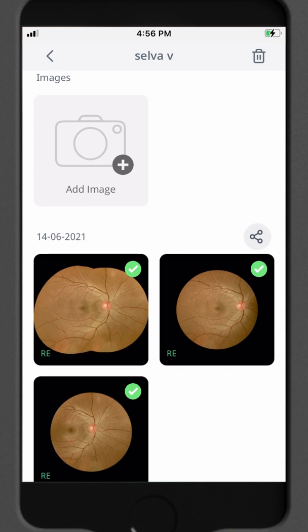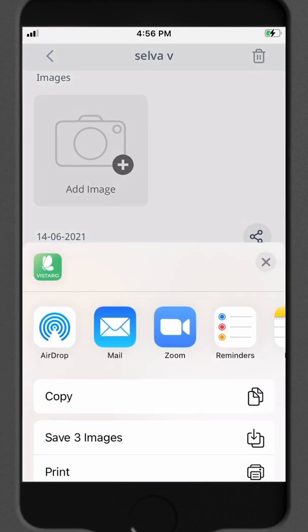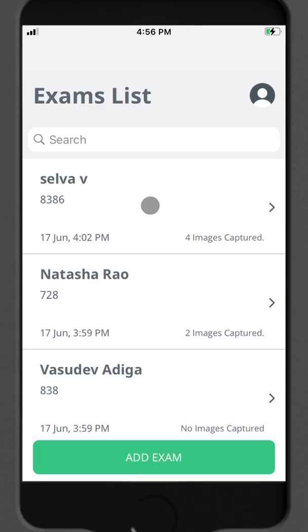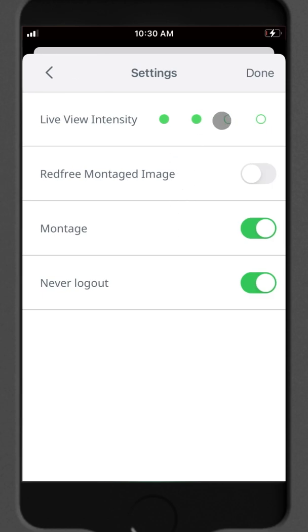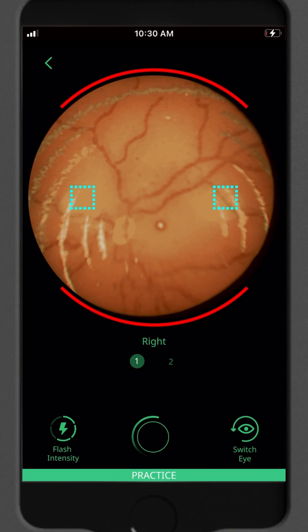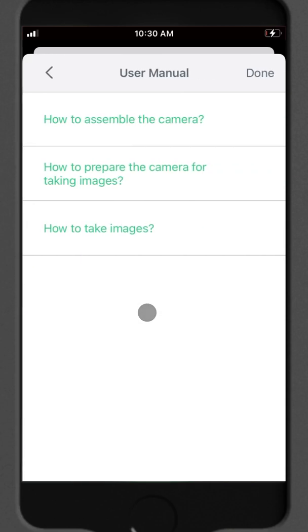Sharing and printing images is really easy — just click on this icon and all your options will show up. Under settings, you have a few options: you can adjust the live view intensity, turn on montage images, and choose if you want to keep the app always logged in. You also have a practice mode which allows you to take images without saving them. If you're having any trouble using Vistaro, the user manual is right here for help.